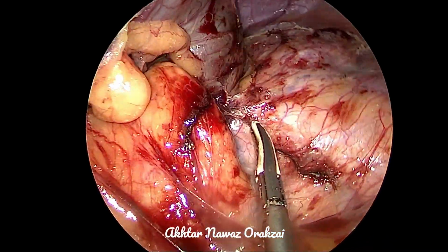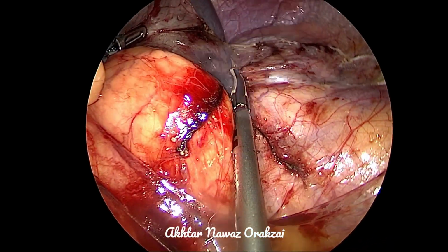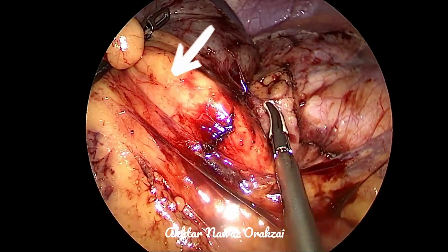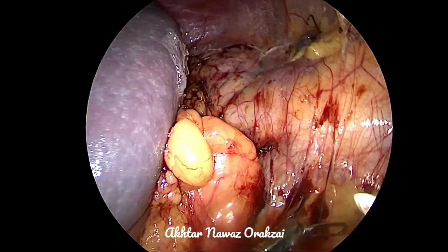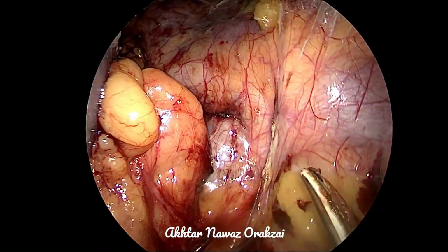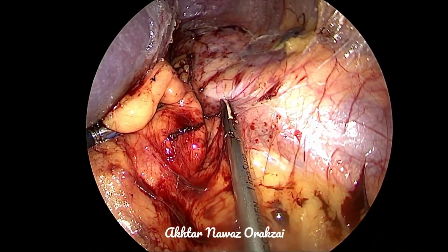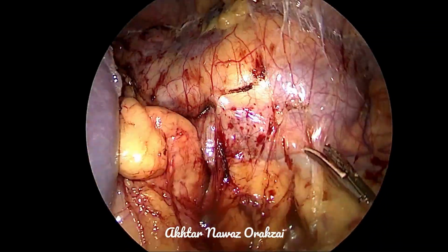You can see here the adrenal is in vision now, and we can also see the tail of the pancreas. The arrow is pointing towards the tail of the pancreas. So we come a little more downstairs. It will depend upon the habitus of the patient, whether it is fatty or it is thin lean. All these amount of dissection or the extent of dissection would depend upon that.